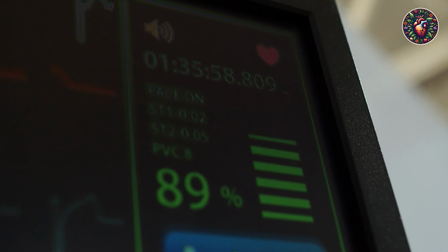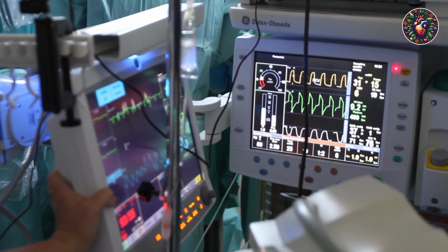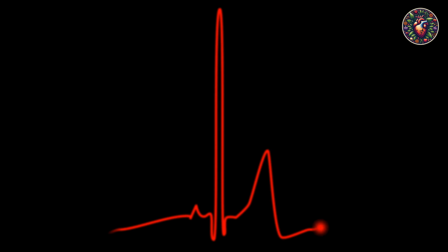Ever heard that beep beep sound? You know, that terrifying sound often associated with a heart monitor. It's actually the sound of the heart's electrical activity being measured and monitored, and it is accompanied by some squiggly lines. Those are the ECG waves. Let's dive into understanding these squiggly lines, known as the ECG.